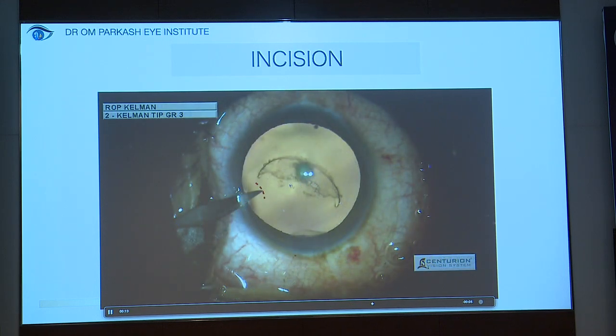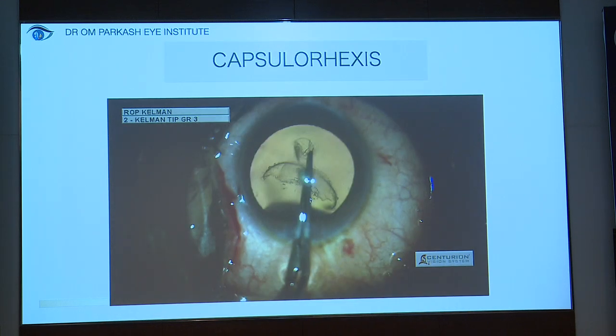The second most important part is the side port one, because we need stable chamber settings; by all means we do not want an undue efflux of fluid from the side port. So side port incision should also be taken care of. Side port calibration and site of incision relative to the axis of the posterior capsular tear is also very important.